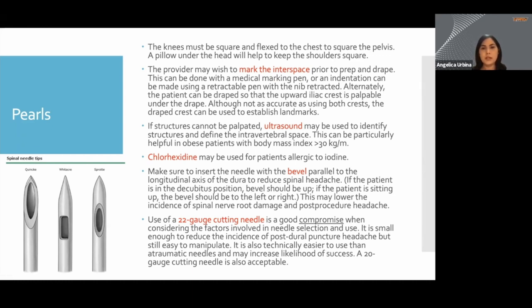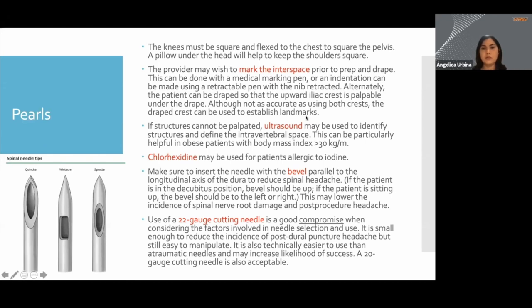The retractable pen or hub of a needle will leave a little indentation on the skin that you will be able to see after you have cleansed the region and prepared your supplies. If you suspect a difficult procedure or can't palpate your landmarks, you could use ultrasound guidance or fluoroscopy.